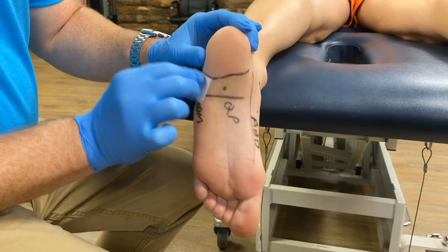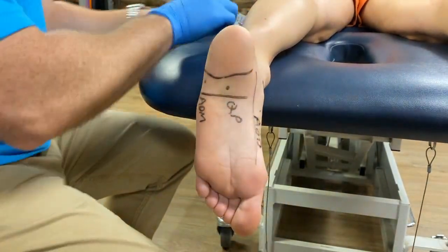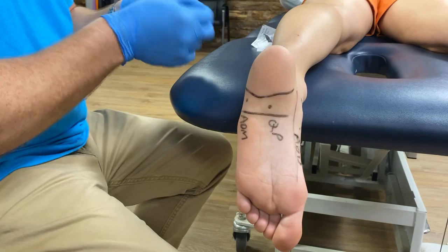We'll maintain a clean technique — we'll always use an alcohol wipe down and always wear gloves. I would normally scrub the foot with alcohol, but I didn't want to wipe off all the writing for the purpose of this video.